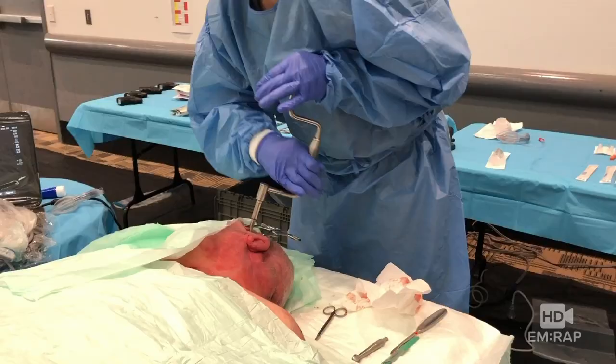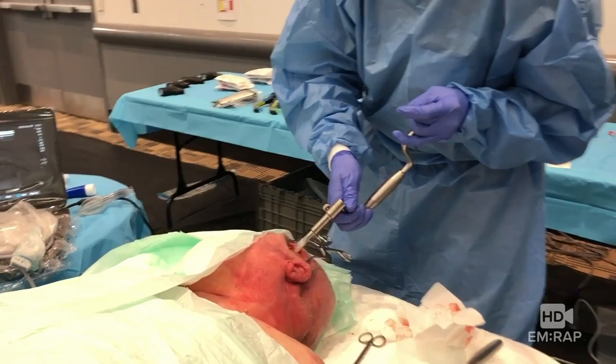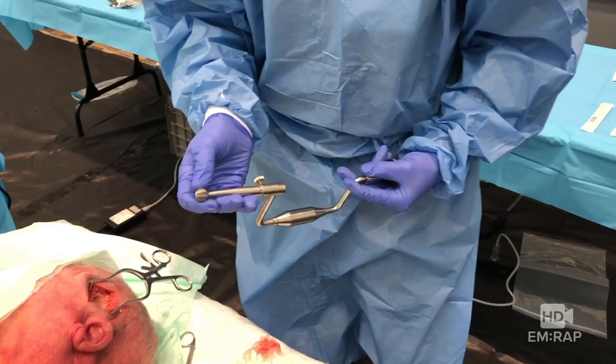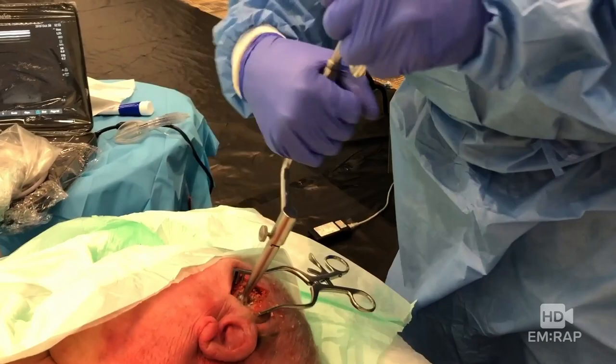With the Hudson Brace, you're going to start to get a jerking motion that you'll feel as you get into the inner table of the skull. And you can see that here — this layer is much softer. So now it's time to switch to the conical burr. This will now clean out the area and expose the dura mater underneath. The non-rotating hand should provide counter-torque and resist forward motion of the drill so you don't plunge it into brain parenchyma.